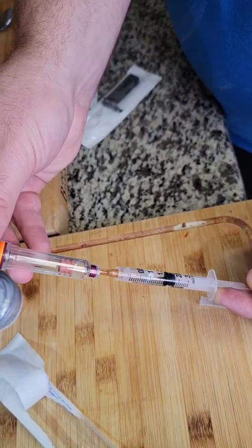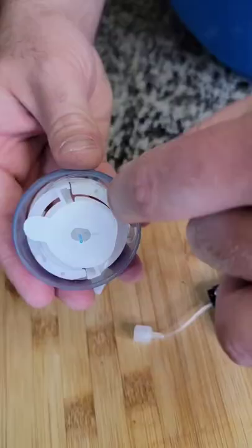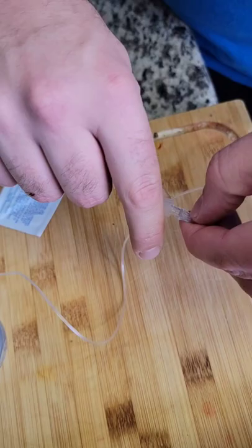Next, we're gonna take some air out of her new cartridge and then inject the insulin into it. Then we're gonna unravel all the tubing for her injection site and connect it to her cartridge.